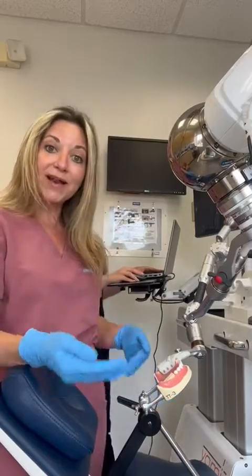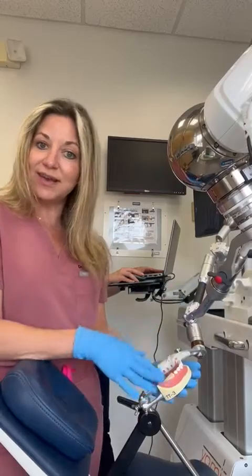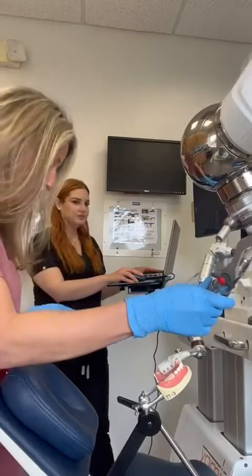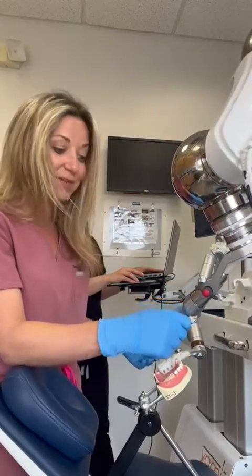I'm going to go ahead and show you a live demo on how to use the Yomi. We're using a demo here so that you guys can be comfortable watching, and here we're going to place an implant on number 32, which we normally wouldn't do in the mouth because that would be a wisdom tooth.